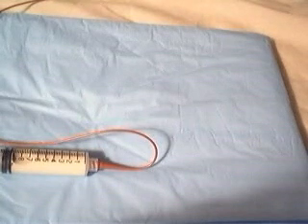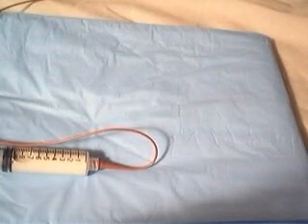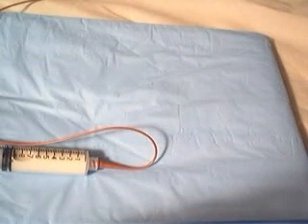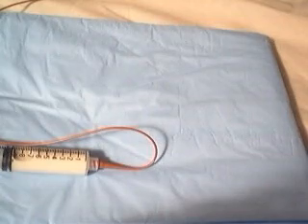Was a little boy. He weighed 2.5 ounces, which is sort of what he weighed this morning, and we gave him 2.5 cc's of the solution. He's back in the nest, and he's being thoroughly cleaned by Mom.